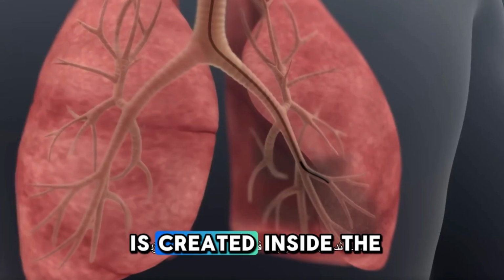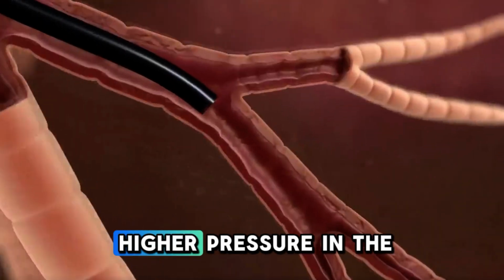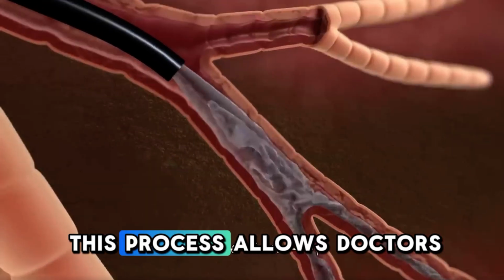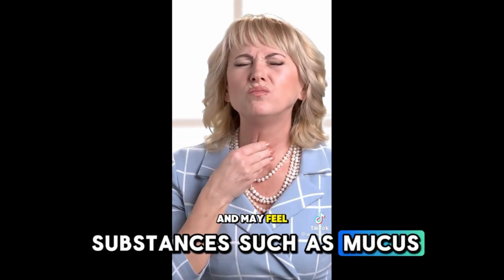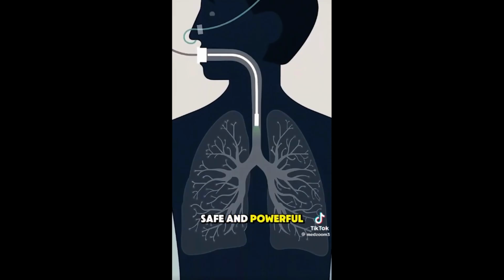In bronchoscopy, a low pressure region is created inside the tube, causing fluids to move from a region of higher pressure in the lungs to a region of lower pressure inside the bronchoscope. This process allows doctors to safely remove substances such as mucus, blood, and foreign particles from the airways.